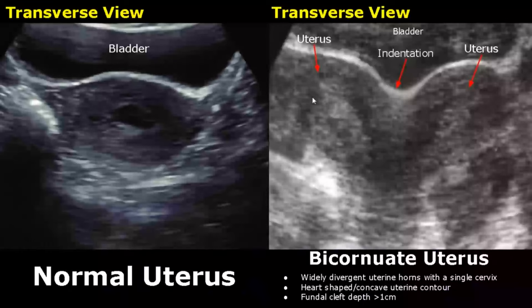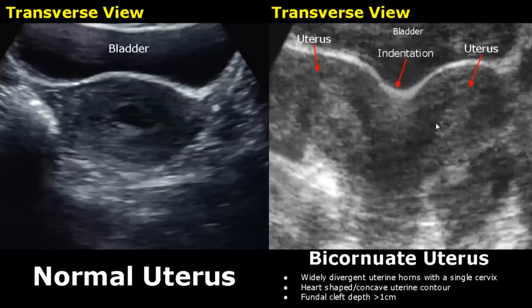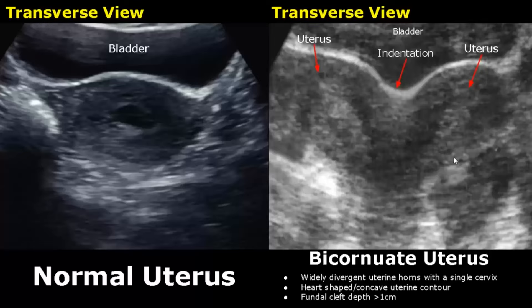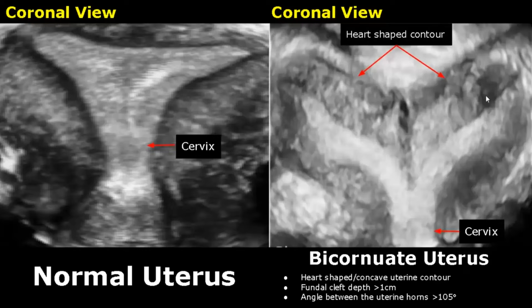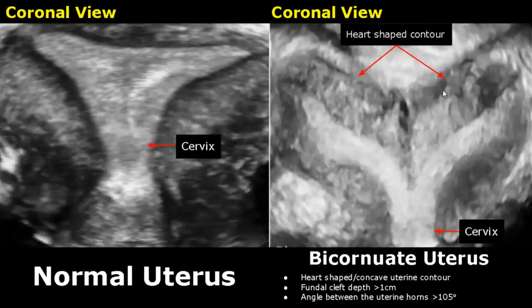In a bicornuate uterus, the uterine horns are widely divergent and there is usually a single cervix. The uterine contour is heart-shaped or concave-shaped. In the 3D coronal view, we can clearly see a heart-shaped uterine contour with the fundal cleft having a depth greater than one centimeter. The uterine horns are widely divergent with an angle greater than 105 degrees. Both uterine horns are connected to a single cervix.